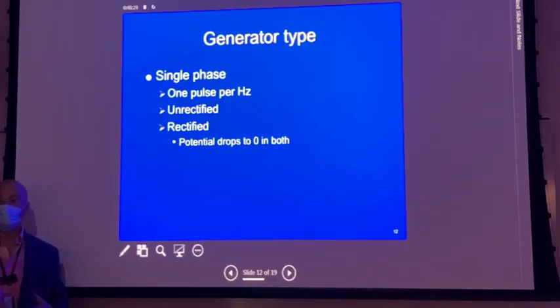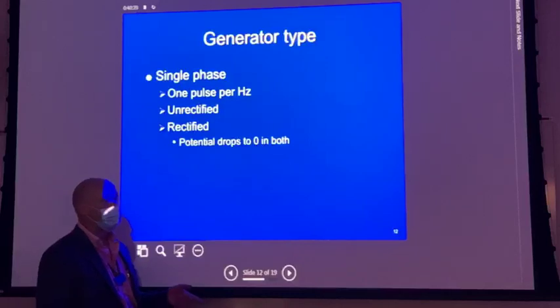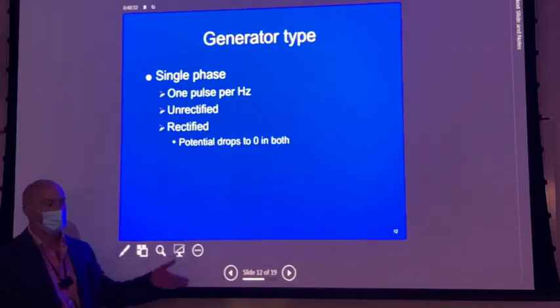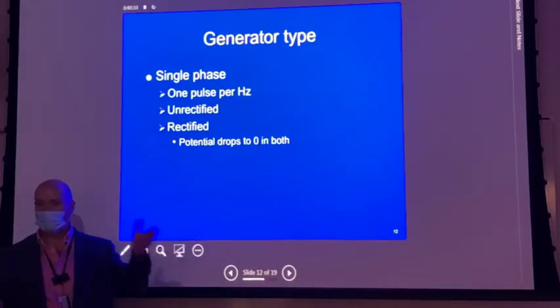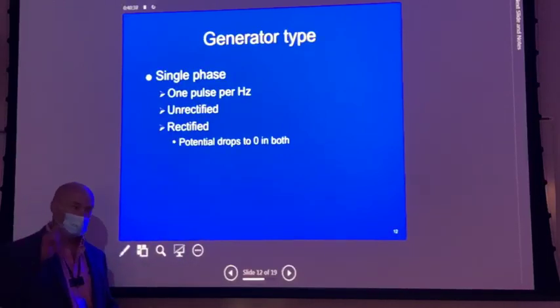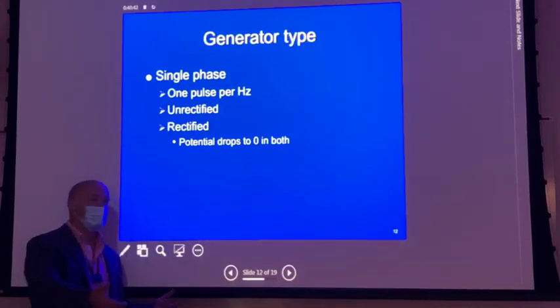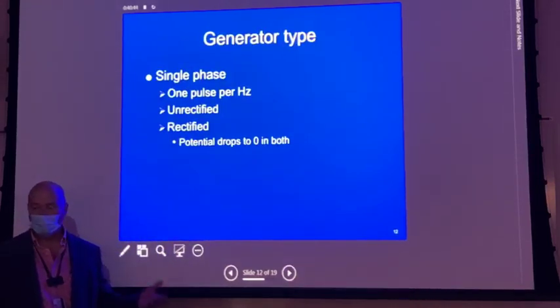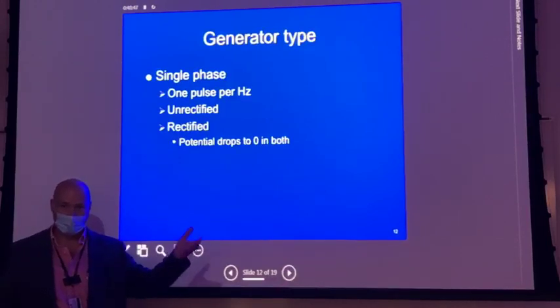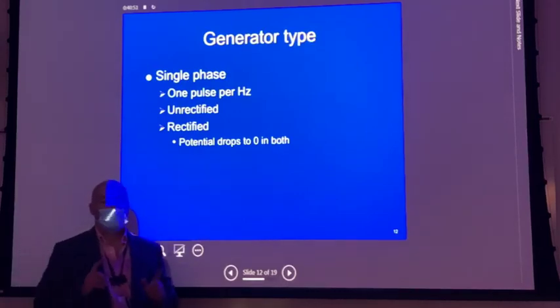Kilovoltage, which is by nature extremely high voltage. So the possibility exists that we could get electrons flowing from anode to cathode. If we can melt the anode, that big thick chunk of tungsten, by sending electrons from cathode to anode, then logically if we send electrons from anode to cathode, what's going to happen to our filament? Destroy it. Yeah, it's a single exposure, it's done.